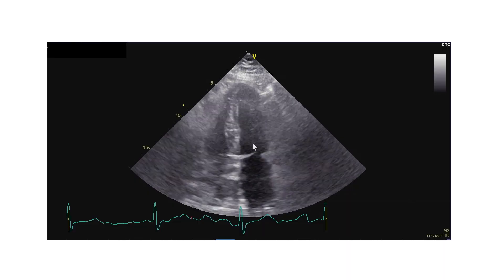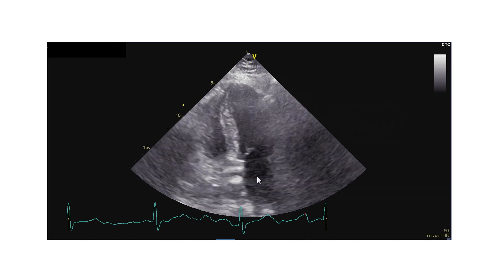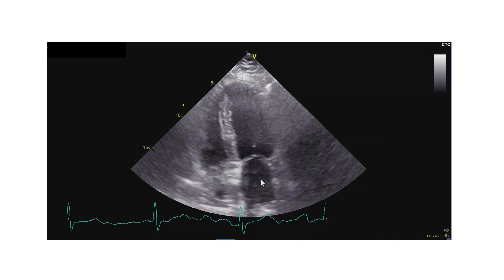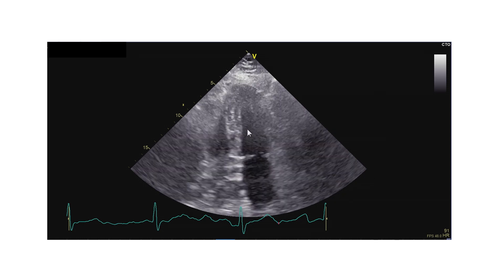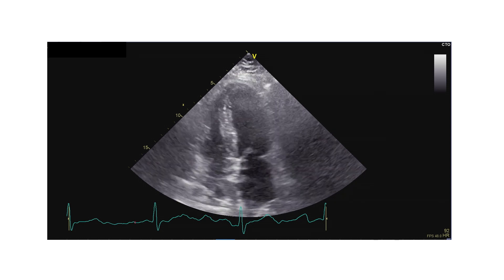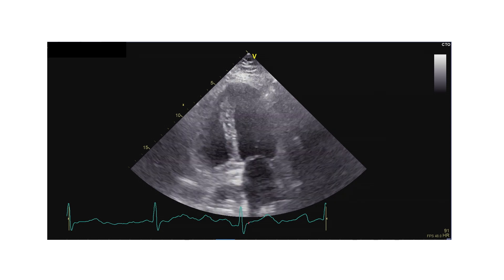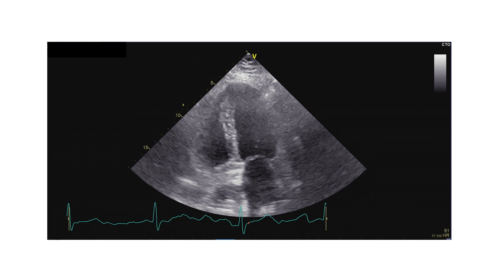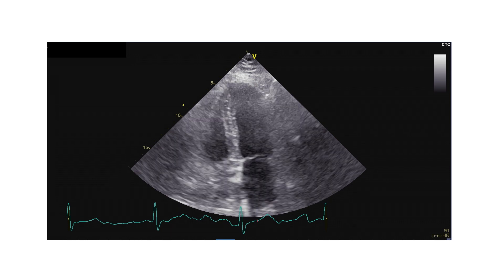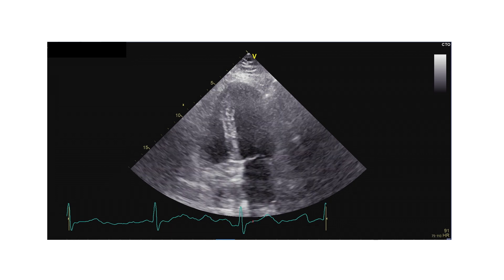What about the left atrium? It's enlarged somewhat. And what about the thickness of the septum? If we measure the thickness here, we do have a thickness of approximately 14 millimeters, which means she has left ventricular hypertrophy.